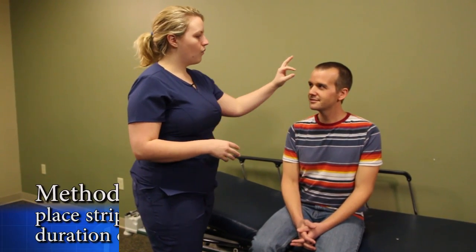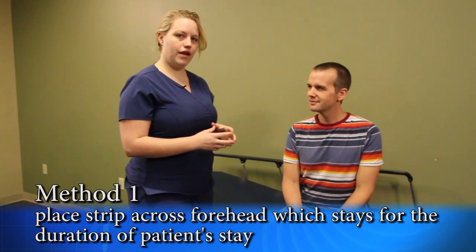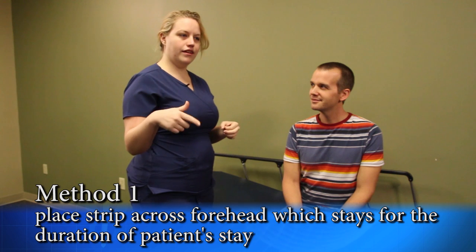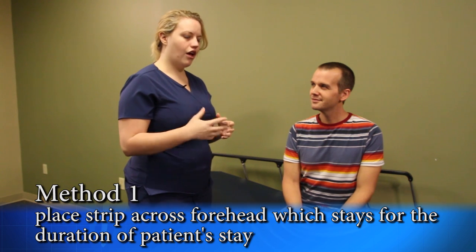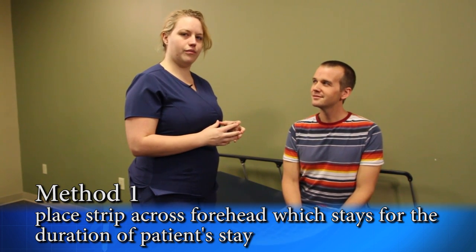Now we're going to discuss temperatures and taking our patient's temperature. There are several ways that we can take the temperature. There's one used often in pediatric settings where we set a bar that sticks on the patient's forehead and it will give us a continuous temperature reading, although this is not one of our more accurate forms of temperature.